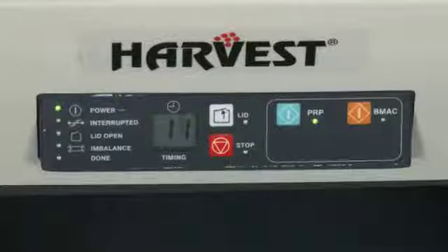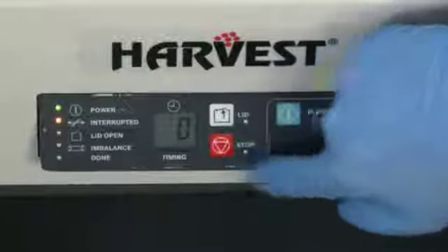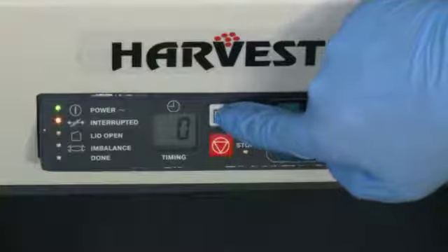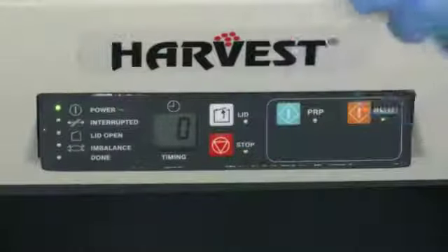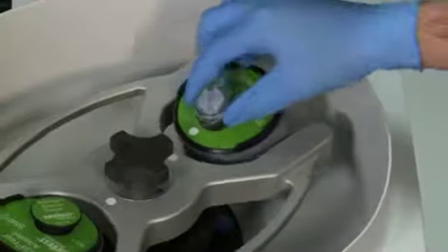Once the display reads 10 on the SmartPrep 2 control panel, press the red Stop button to stop the centrifuge cycle. An audible alarm will sound once the cycle has been completed and it is safe to open the centrifuge lid and remove the process disposable. Remove the process disposable from the centrifuge.